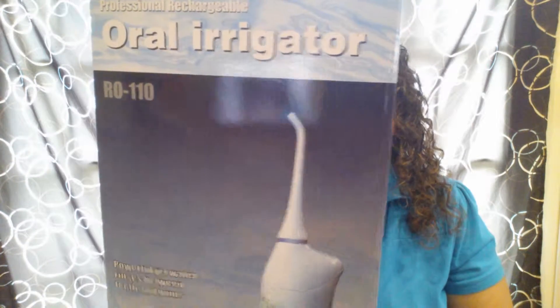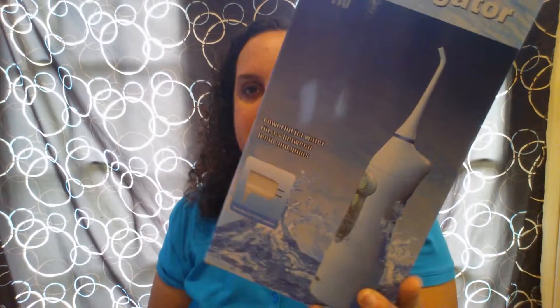Hi everybody, I'm here with a product review for you, and today I have the Gurin Professional Rechargeable Oral Irrigator, model number R0-110. It's also called a water flosser, and I am so excited to try this product out and review it. I was provided this at no charge from the seller in exchange for an honest and unbiased review.